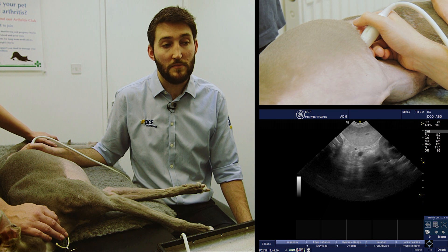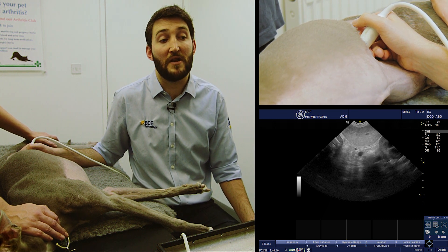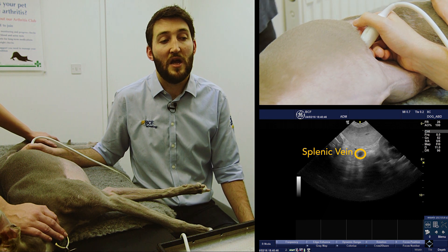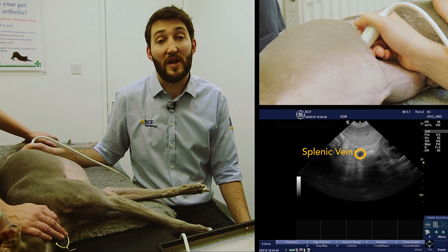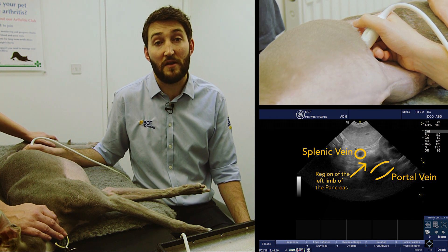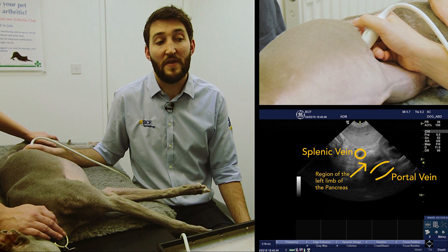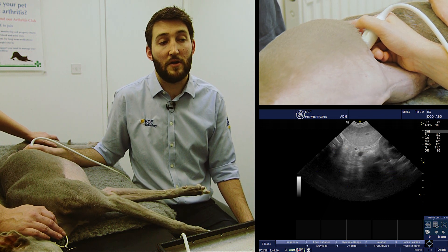In the top left of the screen we can see a little bit of spleen just below the kidney, and to the right of the spleen we can see the splenic vein. Looking between the splenic vein and the portal vein, we can see a region of gray isoechogenicity compared to the surrounding tissue — that's the region of the left limb of the pancreas.